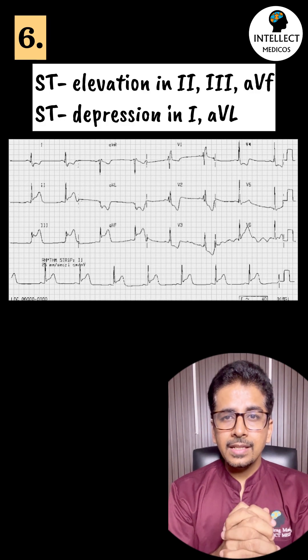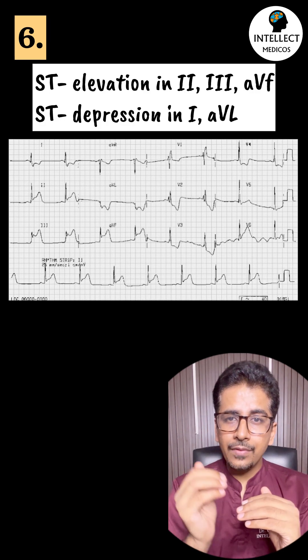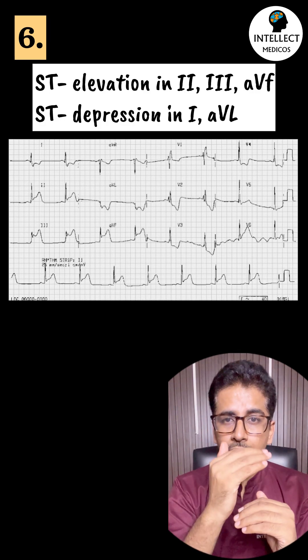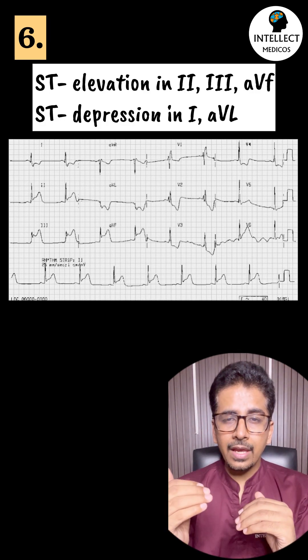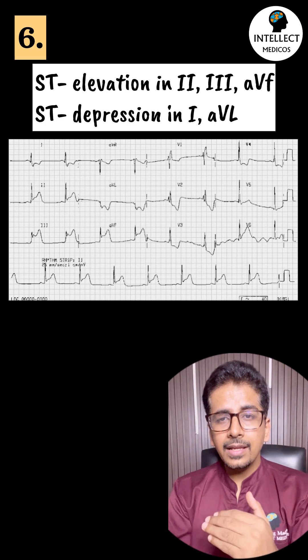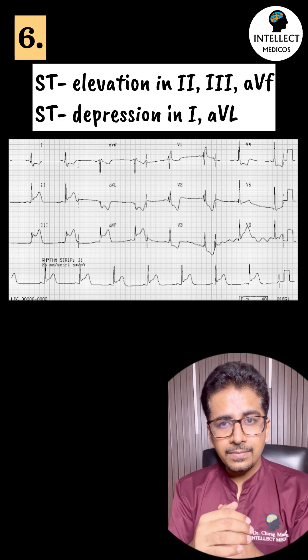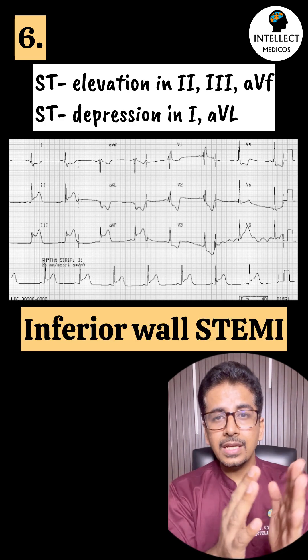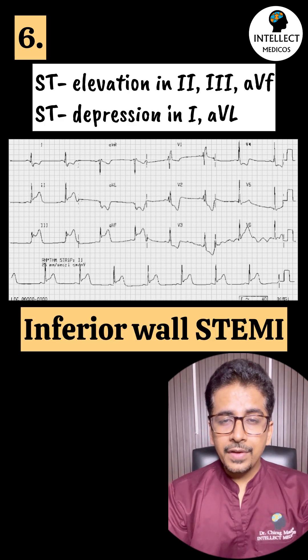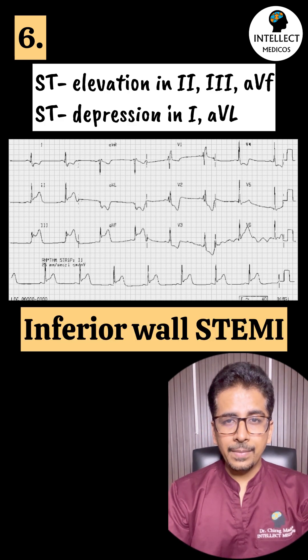Sixth: there is ST elevation in leads 2, 3, and AVF, and ST depression in the lateral leads. This is inferior wall STEMI.